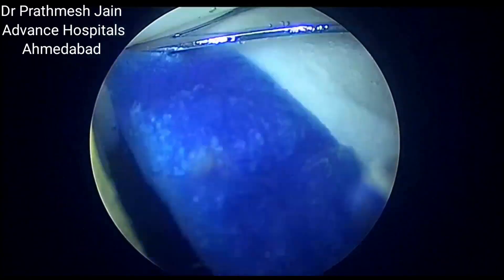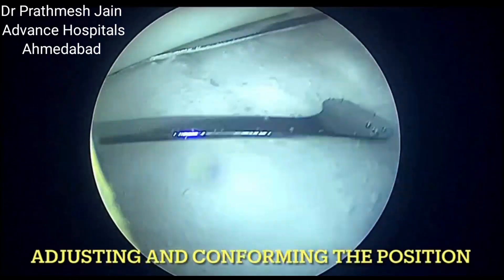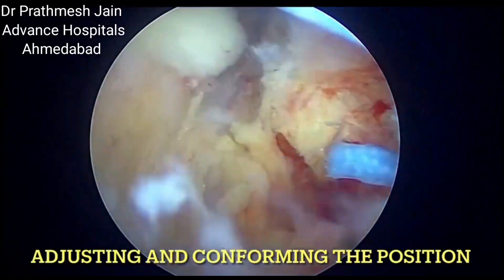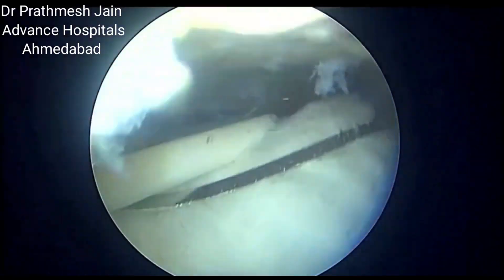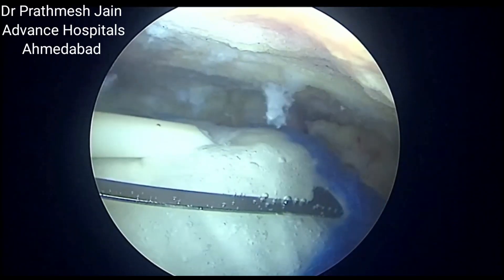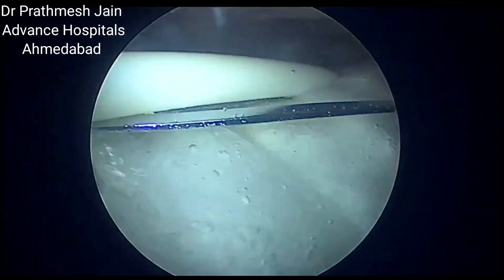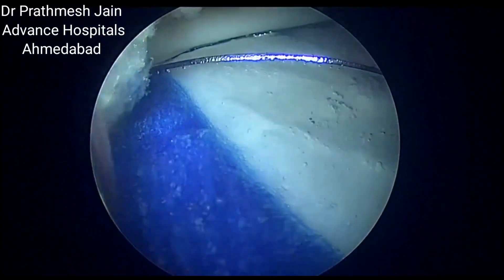Here we can see that the Regenten patch is deployed. It is adjusted to the correct location. We need to be sure that about two-thirds of the graft is on the rotator cuff portion and about one-third of the graft is on the bone.